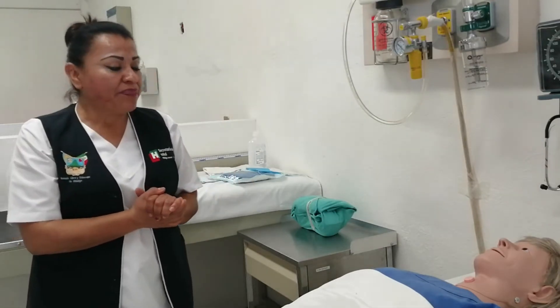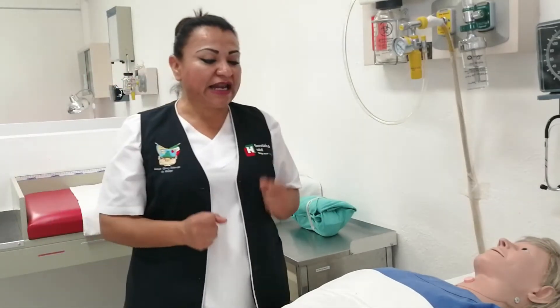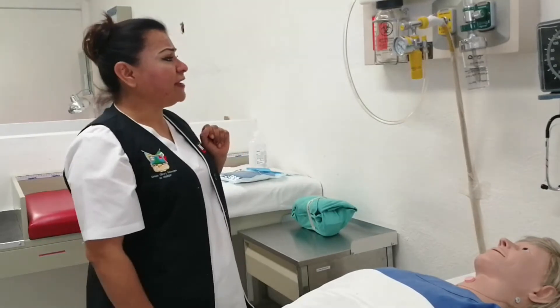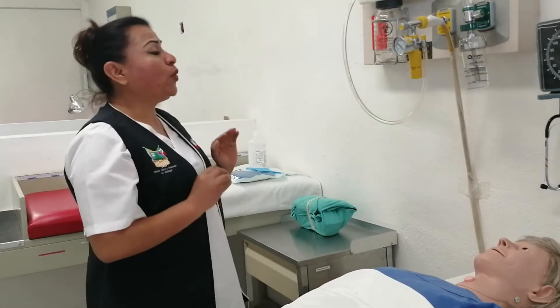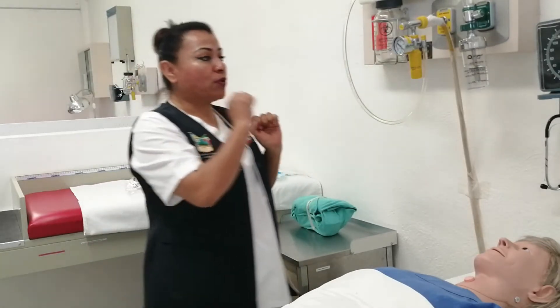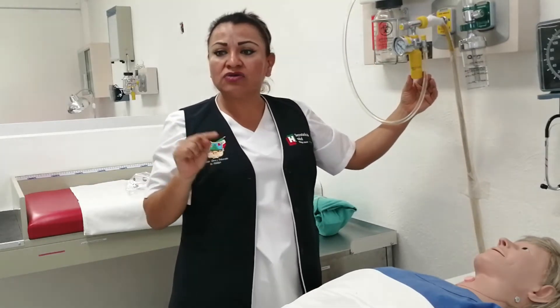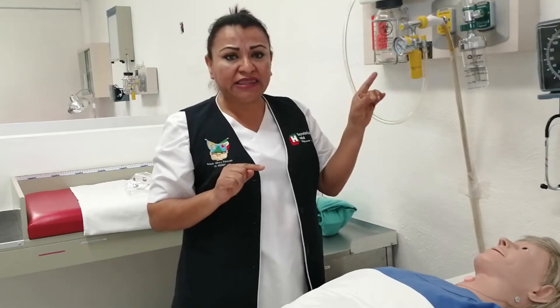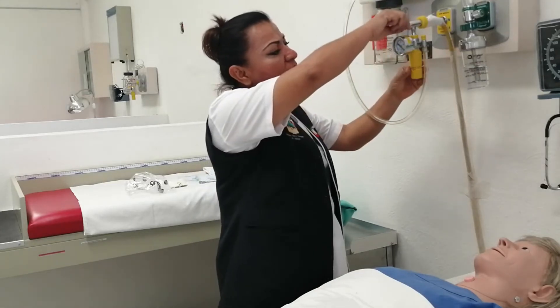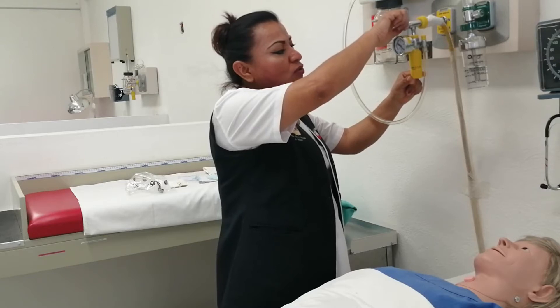En la unidad del paciente, voy a identificar que sea mi paciente — recuerden que es muy importante identificarlo por nombre y apellidos — y le voy a explicar el procedimiento, qué le voy a realizar y por qué. Es importante verificar la funcionalidad del material y equipo. Verifico que el aspirador sea funcional y lo ajusto a 80 a 120 milímetros de mercurio para el paciente adulto, revisando el manómetro.